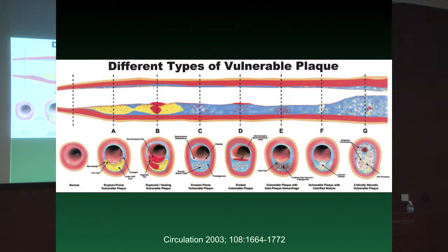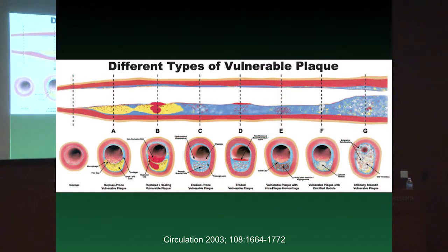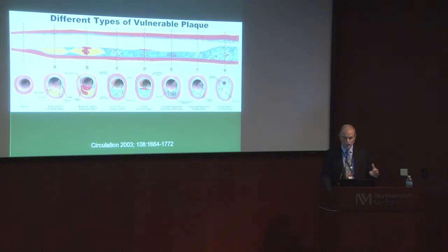So first, there was a group of really excellent researchers from the American Heart Association, understanding what is a vulnerable plaque and a vulnerable patient. And although there's a lot of complexity in this, from an imaging standpoint, there's two areas that we can readily identify that researchers have shown us, and early in the stage is a lipid-rich necrotic core. The best way to explain this is basically a pocket of pus sitting in the wall of the carotid artery. And we can see it like we see pockets of pus anywhere else, as a non-enhancing area with an enhancing rim around it on a T1 weighted image.